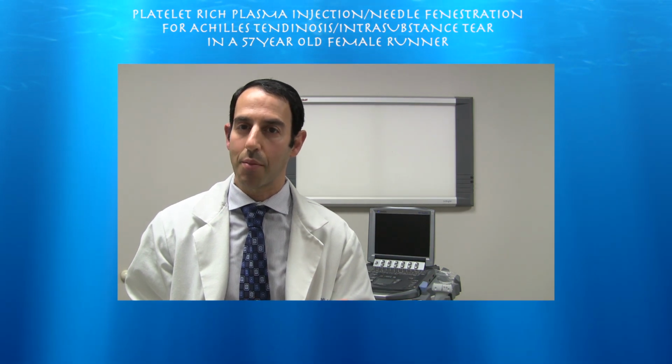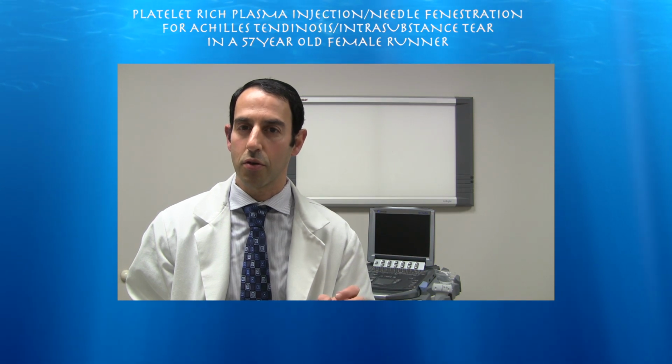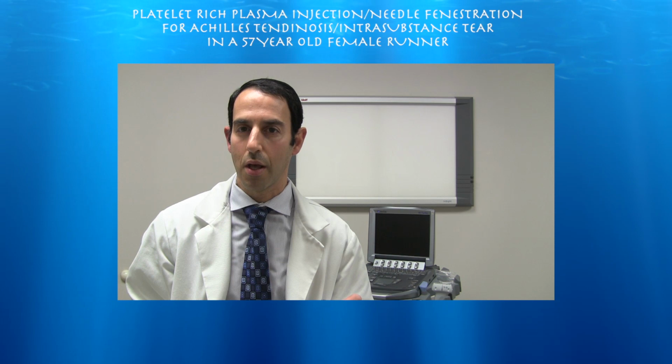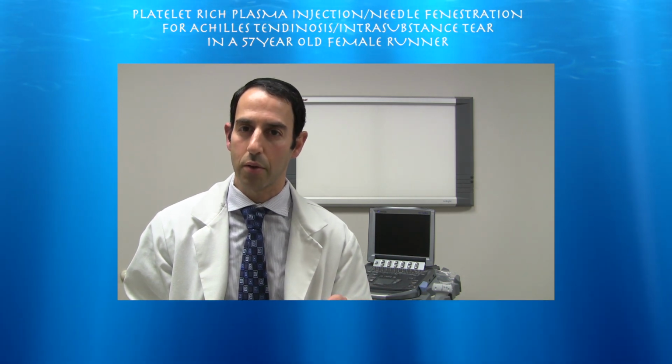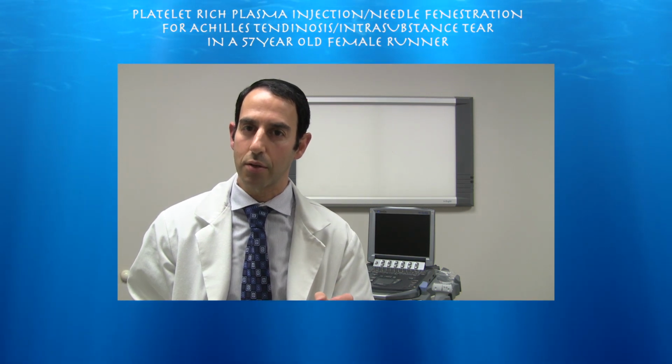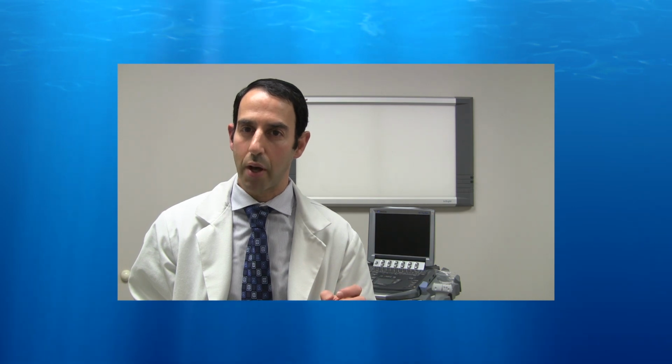We then went ahead and did a platelet-rich plasma injection using ultrasound guidance. During this procedure, you can see that she has a linear intrasubstance tear at the insertion of the Achilles tendon, as well as a small amount of linear calcification distally in the tendon as well. Besides doing the platelet-rich plasma injection, we used ultrasound to guide the needle and do a fenestration of the distal tendon, and then we injected her with platelet-rich plasma.